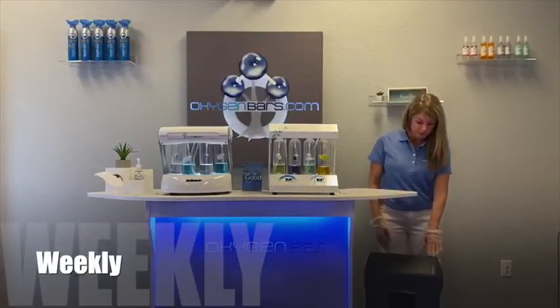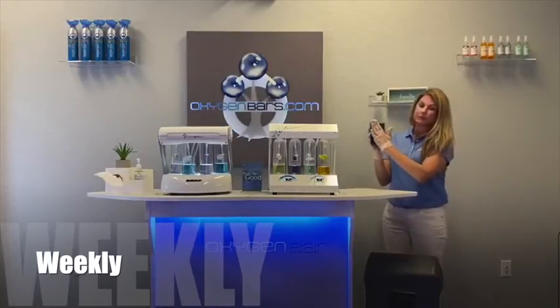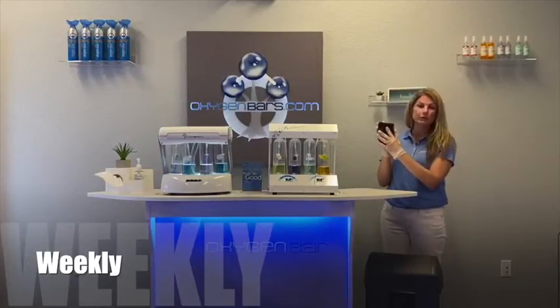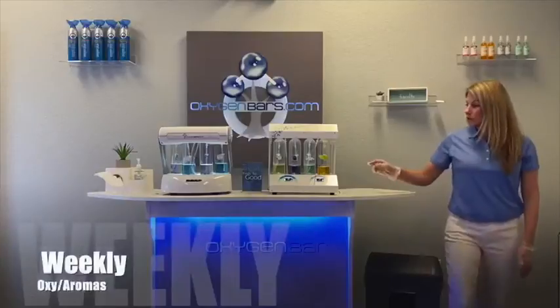Starting off with the oxygen concentrator, or O2 for you — there is a little filter in the back that you pinch and take out. There could be some dust particles on the outside; you'll want to clean that with a mild detergent and water, squeeze it out, let it dry, and replace it back into your unit.